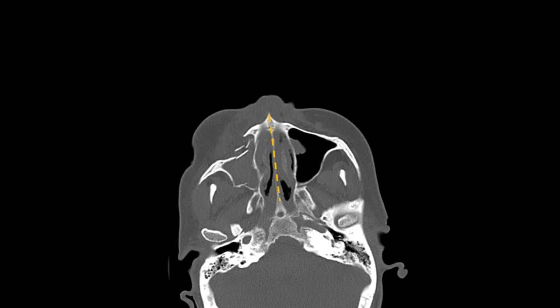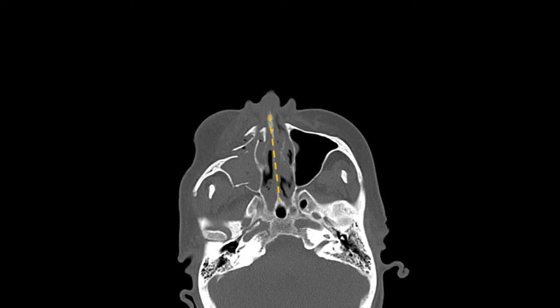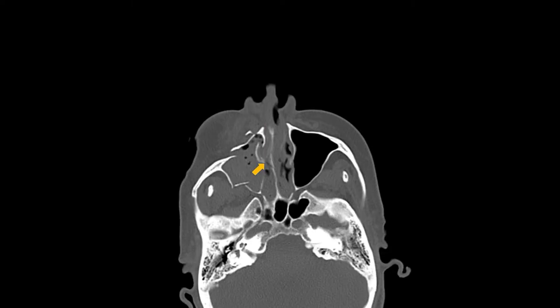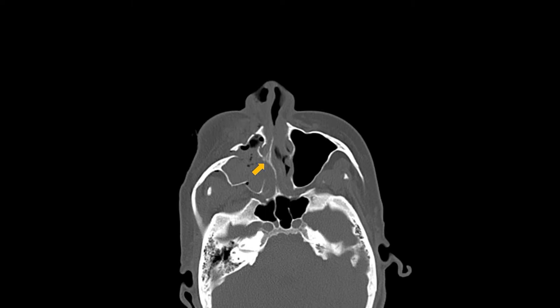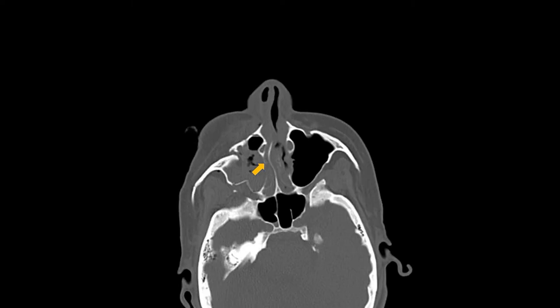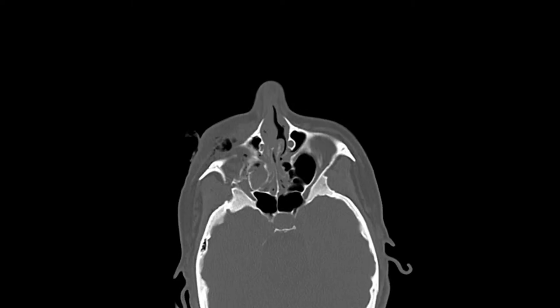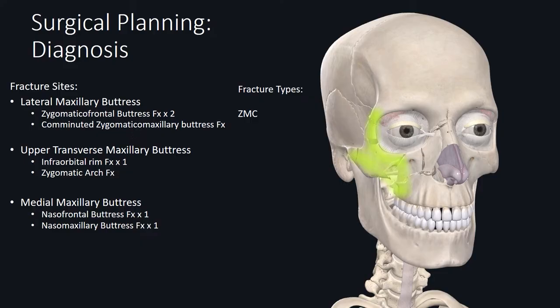Here is another view from the axial. You can see that it starts out relatively straight, then starts going over to the right, with the large septal spur touching the lateral nasal wall. The right nasal airway is completely collapsed, then it becomes straight again more superiorly. When you combine these individual fracture segments, you have a zygomatic maxillary complex fracture from the involvement of the zygomatic frontal, zygomatic maxillary, zygomatic arch, and infraorbital rim.